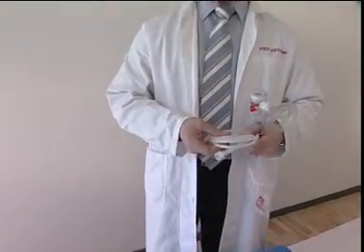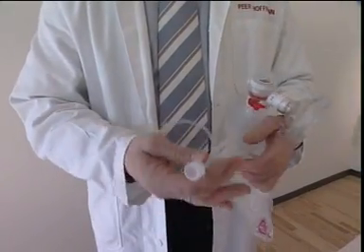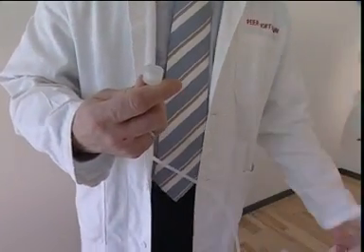The O2 tube can be connected with an oxygen source. The oxygen supply is working correctly if the reservoir bag is inflated.